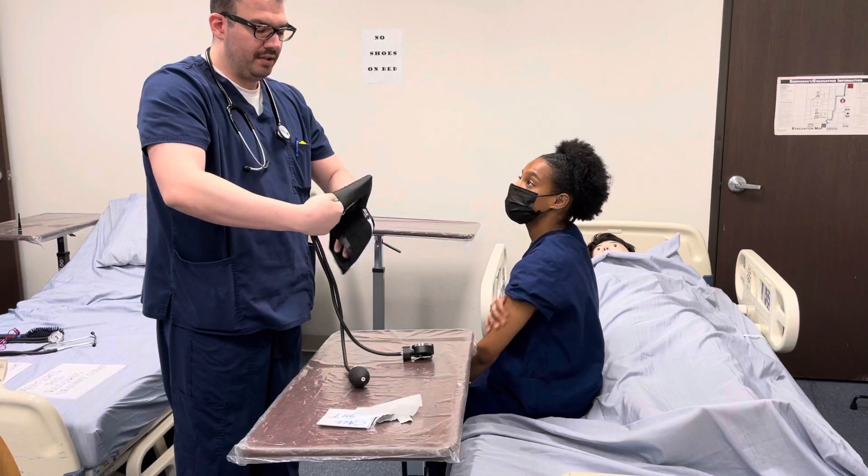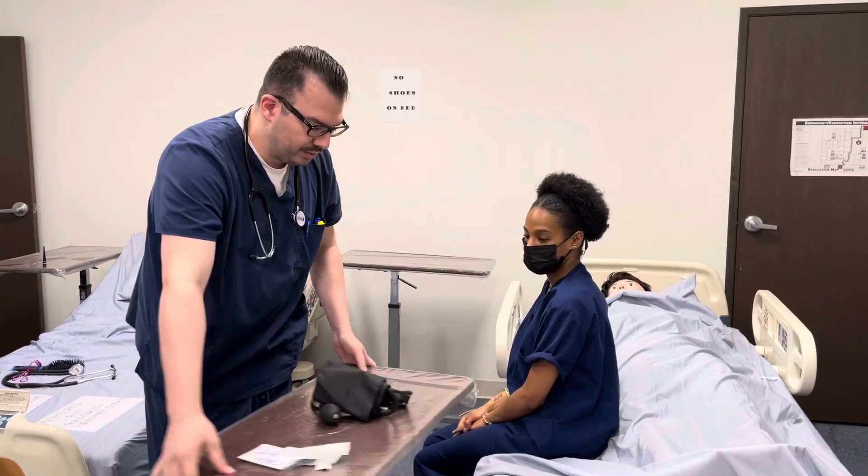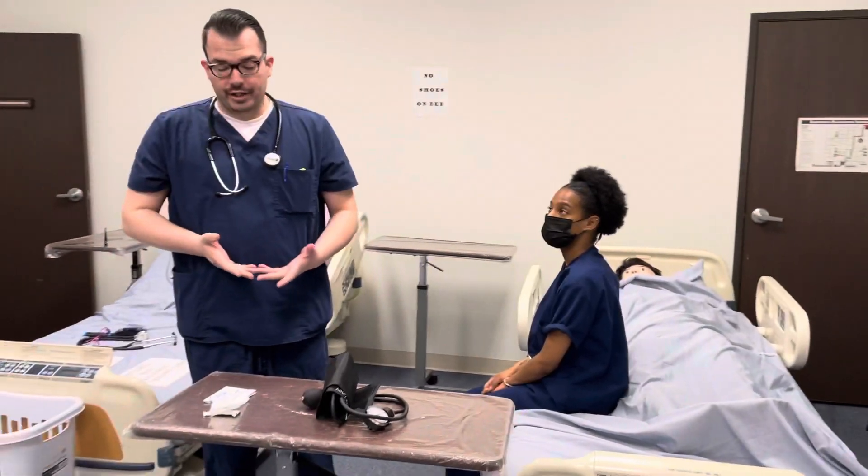I'll make sure that I don't keep the blood pressure cuff inflated for longer than one minute, as it can occlude the artery, and I will make sure that I write it out in fraction form.